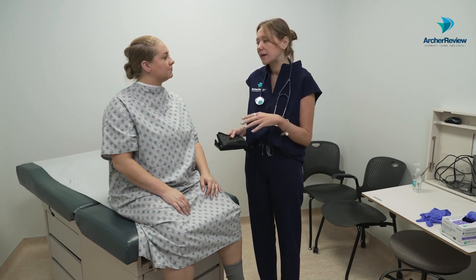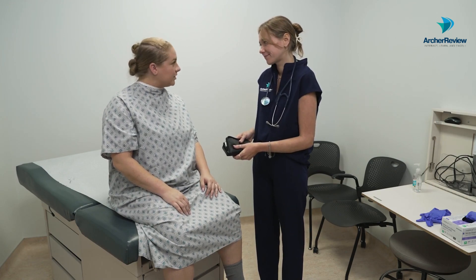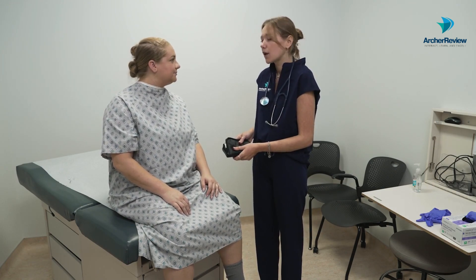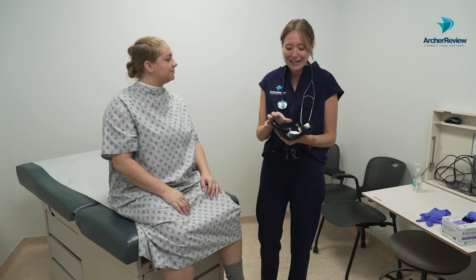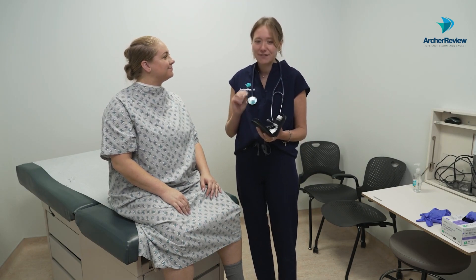After you've gone through that, we want to double identify our client. Would you mind if I just get your full name and date of birth? It's Morgan Taylor, 11/30/92. You can also go ahead and scan these devices along with the identification band if that's available at your facility. Otherwise, double identification with name and birth date is sufficient.